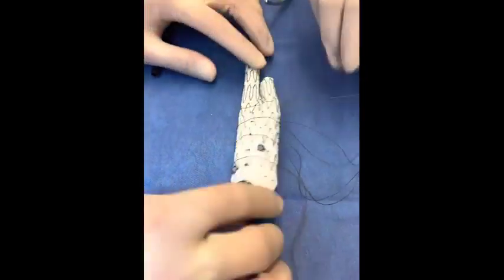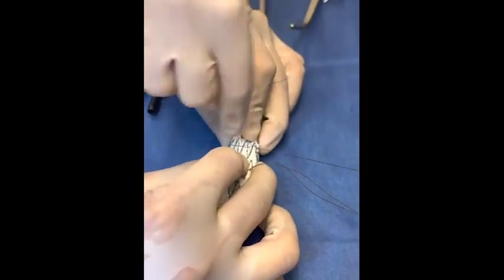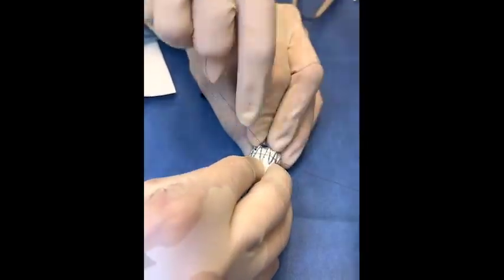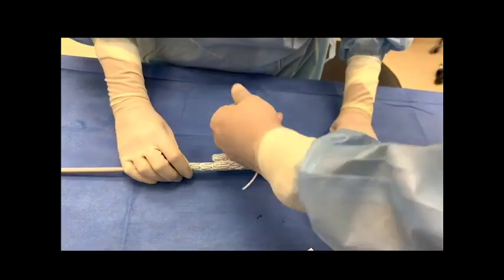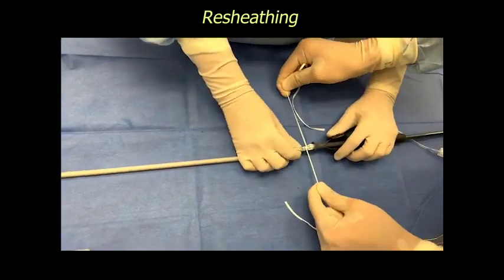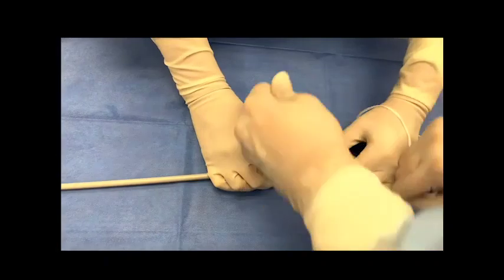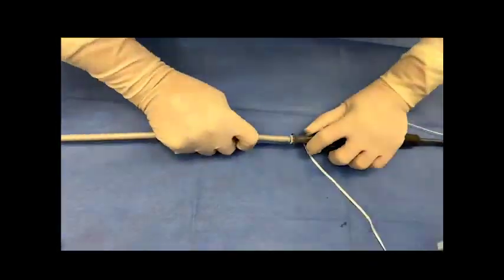With the help of the assistant, we constrain the device and we tie down our chromic sutures to achieve a desired constrainment to help facilitate the maneuverability of the graft and the cannulation. Next, the device is reloaded back into the peel away using the help of umbilical tape to squeeze out the graft. We do this sequentially, and once the device is all loaded back into the peel away, afterwards it can be easily advanced back to its original configuration.